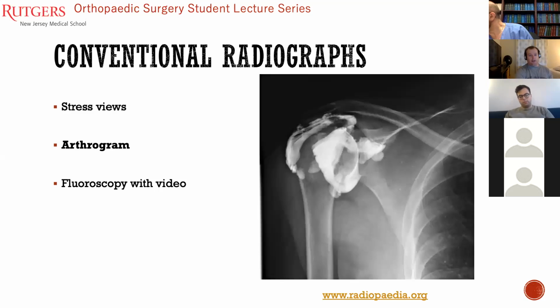Additional tests that can be done with plain radiographs is you can also do an arthrogram. These can be done in pediatrics or adults. Here you see an image of an arthrogram of a shoulder where dye is injected directly into the joint. Since you see the dye going all about the shoulder, it's indicative of a rotator cuff tear because the dye is free to travel between the intra-articular and subacromial space. This type of test has largely become essentially obsolete unless patients are unable to get MRIs, where this will help you delineate some more soft tissue pathology that you wouldn't see on a plain X-ray or a CT.